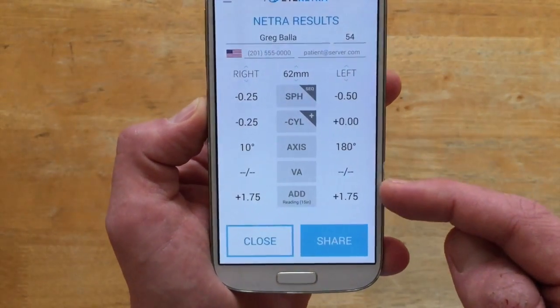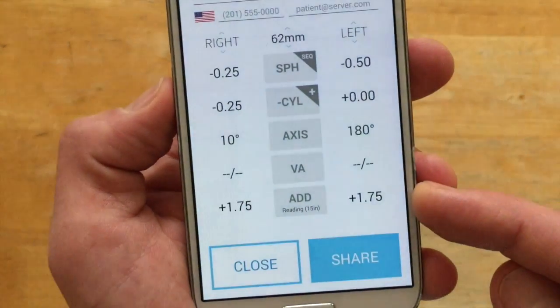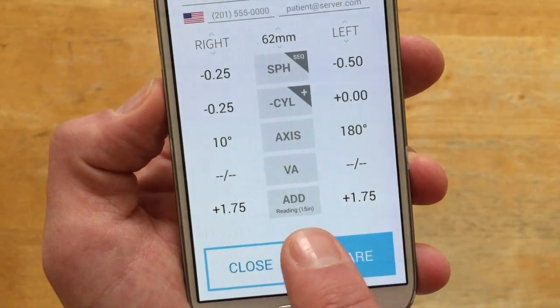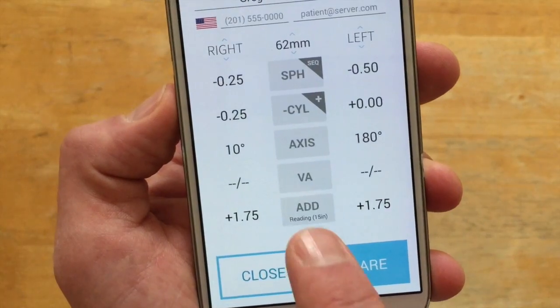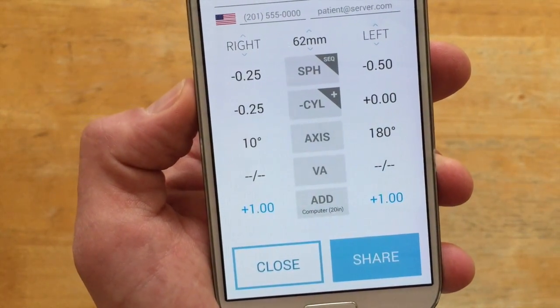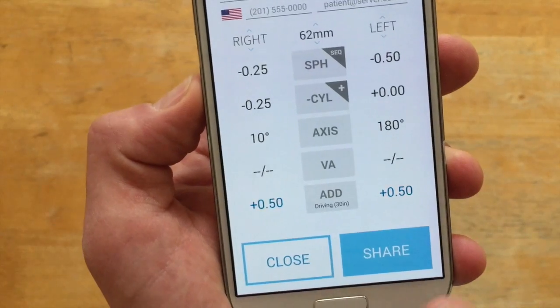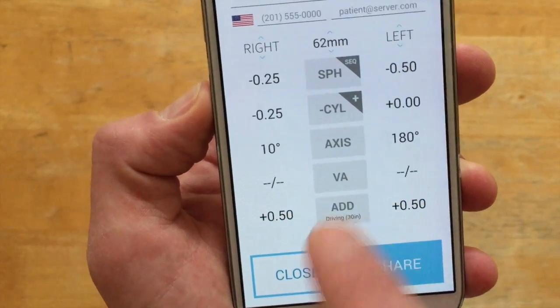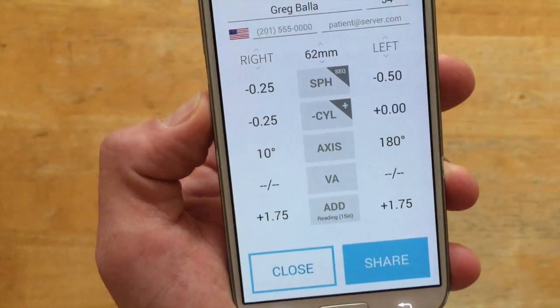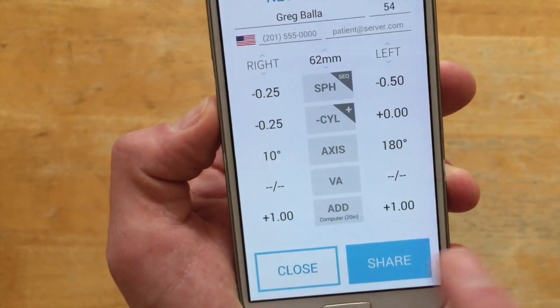As soon as I enter that birth date, an add value appears at the bottom. We can toggle between distances: reading at 15 inches, computer at 20 inches, driving at 30 inches for the dashboard, or smartphone at 10 inches. We'll leave it at computer distance.